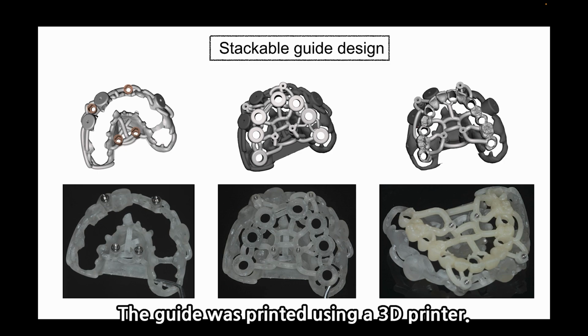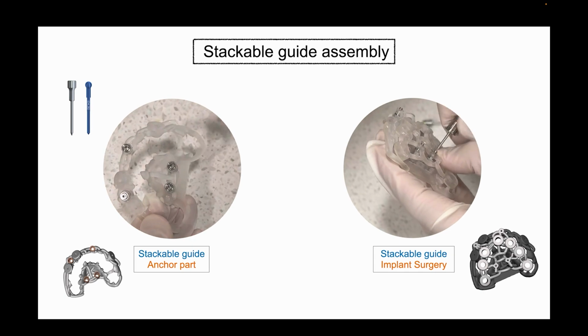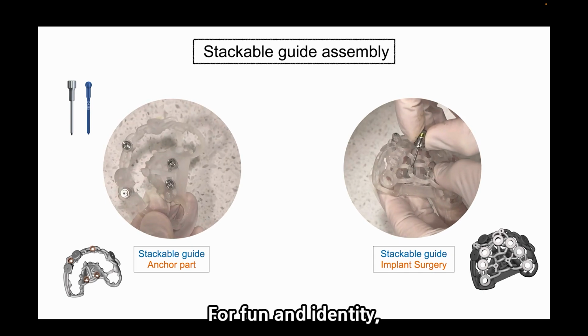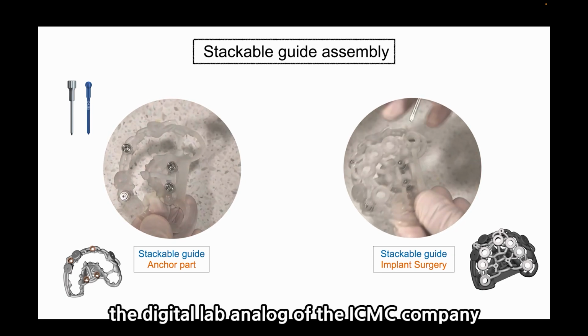The guide was printed using a 3D printer. Sufficient rigidity is very important. For the connection part, the digital lab analog of the ICMC company was used.